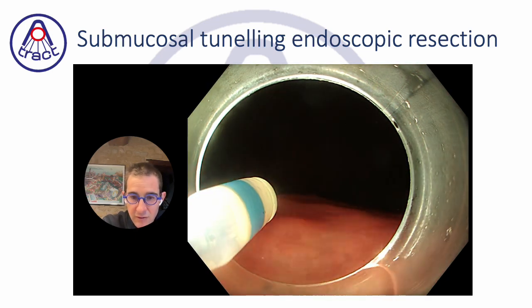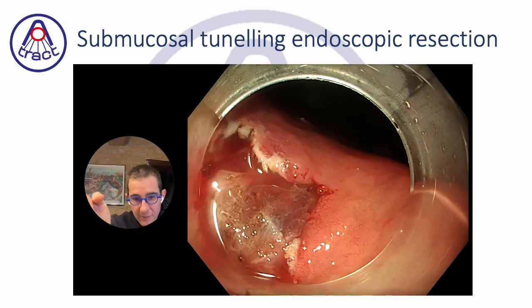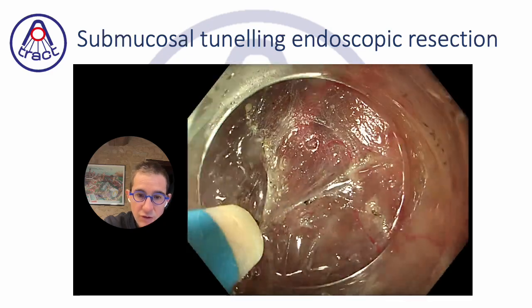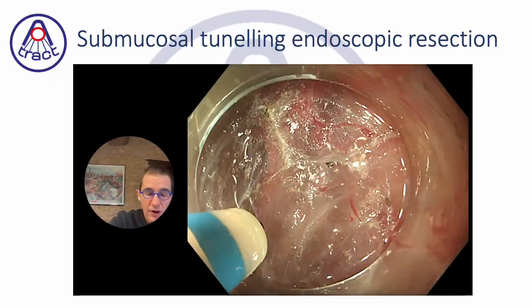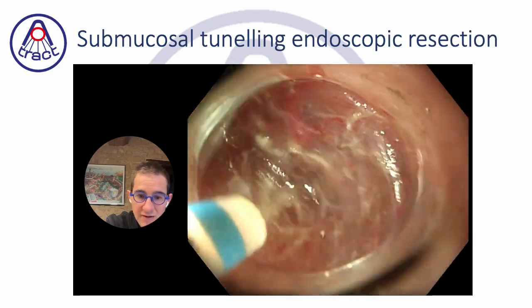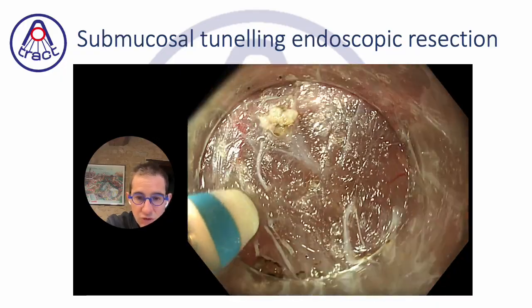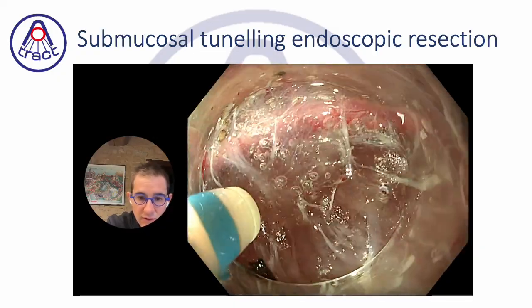The lesion is here. So I could do small markings to be sure I'm going in the good axis, because once I reach the lesion, it will be really difficult to see it from the lumen side, because the injection will make the relief, the shape disappear. So it's very important to control the bleeding axis and to do dots at the beginning to precisely describe the position of the lesion, and if possible to precise the direction of your tunnel while you are progressing in the submucosa.